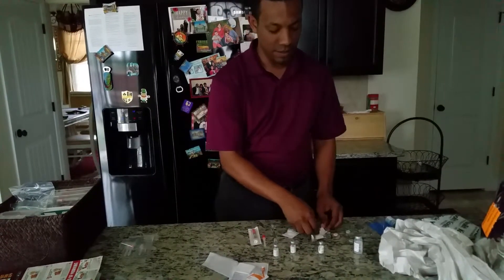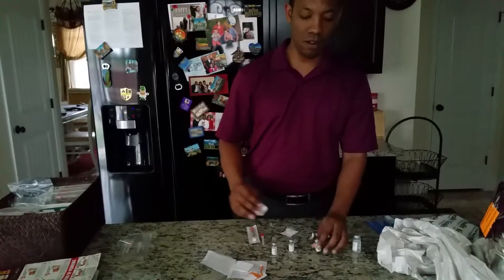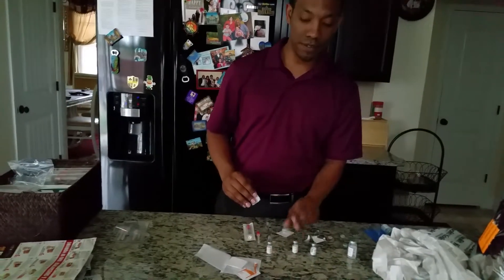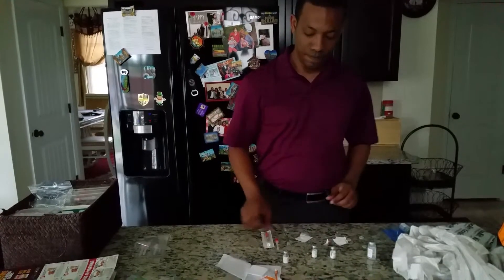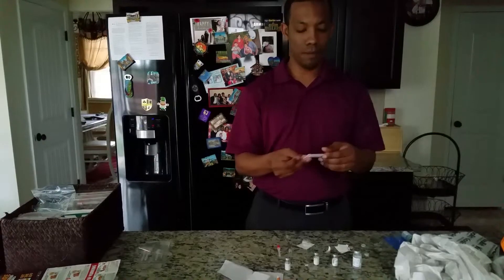Put that off to the side, use my little handy dandy alcohol wipe and wipe those off. Although I already washed my hands, so shouldn't have to be worried, but it's better safe than sorry, right? All right, that's cleaned. Now we've got our leuprolide, which we've already cleaned. A needle just for the leuprolide.